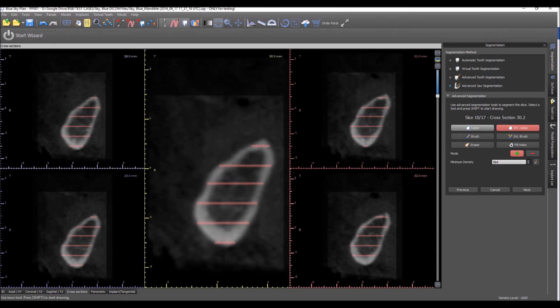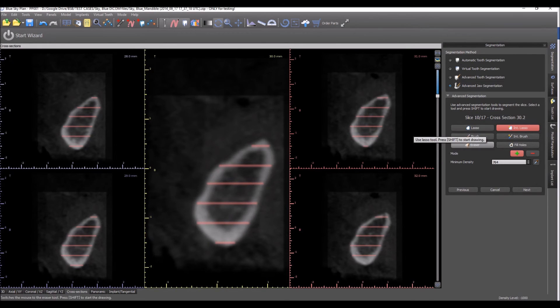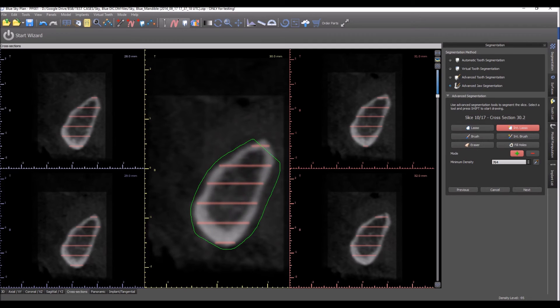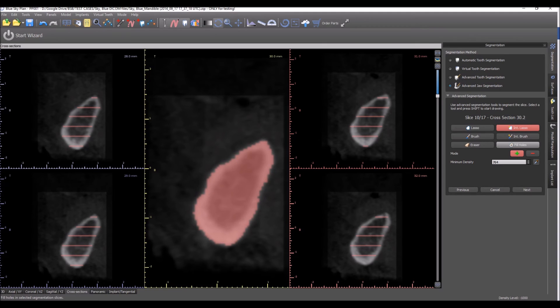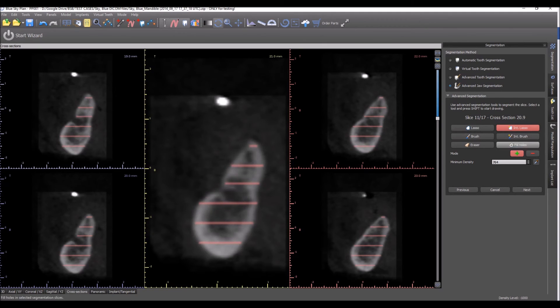Now we're looking at cross section slices. The pink lines that we see on the screen indicate areas that we've already defined using the tools during this process.